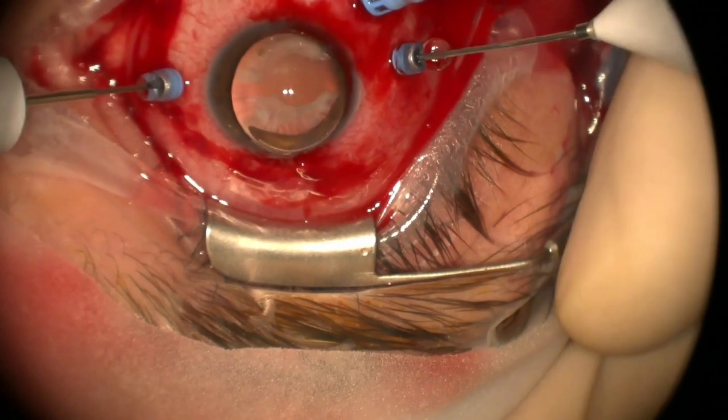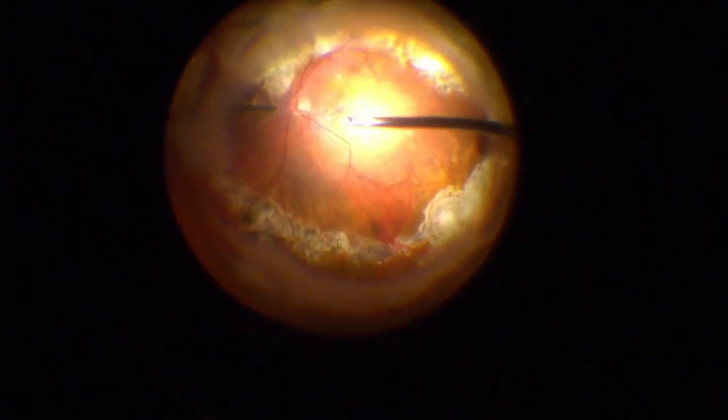She's putting some viscoelastic on the eye for us. Okay. Now we're going to get a look with the wide field first, take a look at the retina, make sure we're staying attached, and then address the macula.